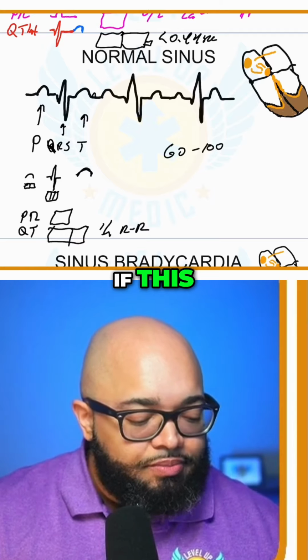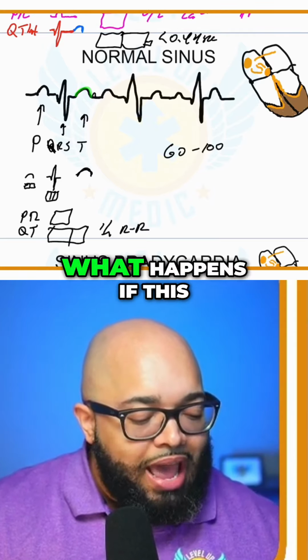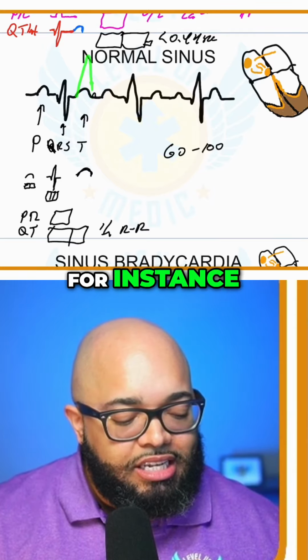Okay? What happens if this T wave, for instance, is peaked?